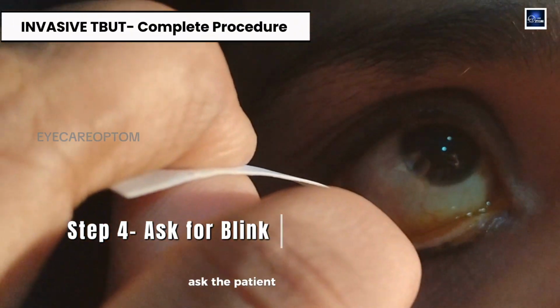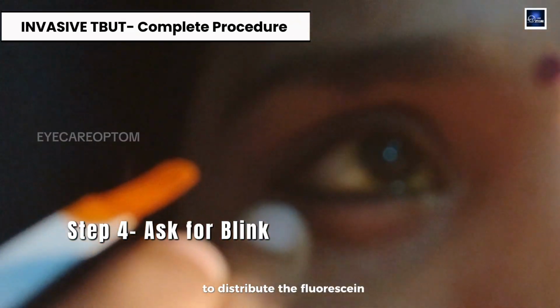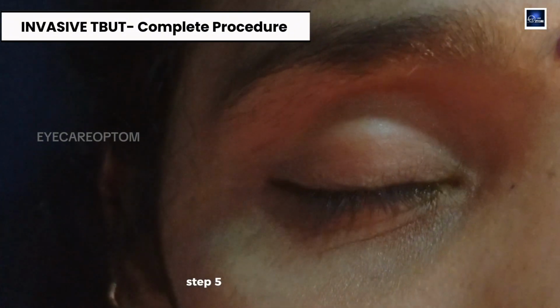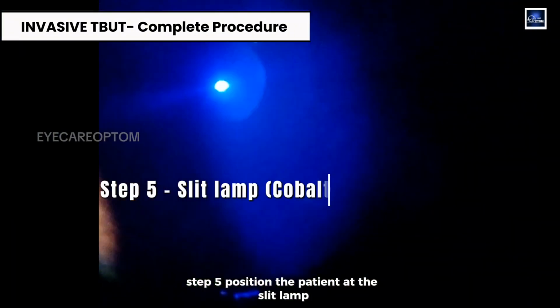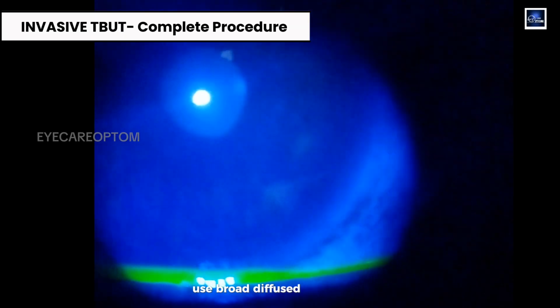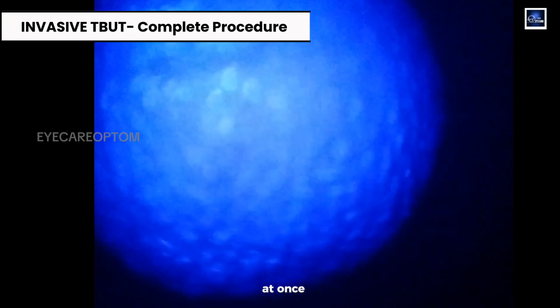Step 4. Ask the patient to blink 2 to 3 times naturally to distribute the fluorescein evenly across the corneal surface. Step 5. Position the patient at the slit lamp. Switch to the cobalt blue filter. Use broad diffused illumination to view the entire corneal surface at once.